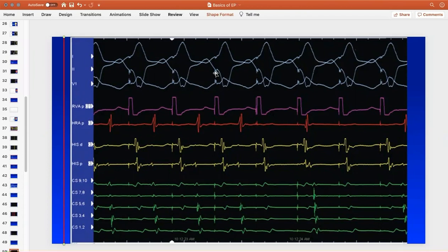Okay, good. So now, are you conducting to the atrium? Yes, it is consistent in the first one, second, third, then fourth. I'm not gonna show the same slide again. Okay, that was a trick. But I think there is some drop here, after the fourth one. Yes. So you lost conduction here.